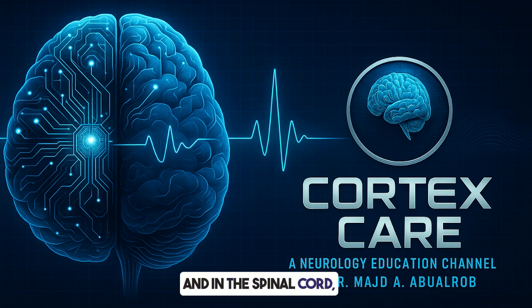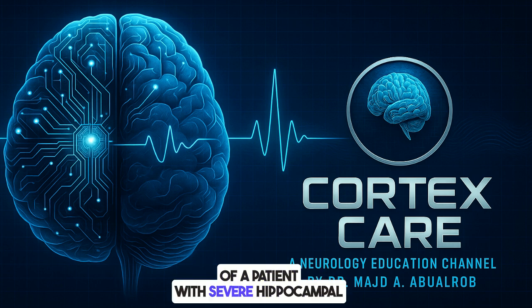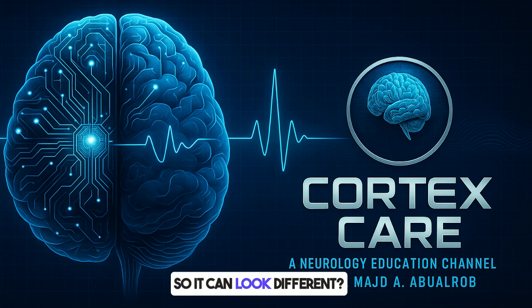And in the spinal cord, about half the patients have LETM, that longitudinally extensive transverse myelitis, usually in the thoracic spine. Is this pattern always seen, or is there variability? There can be variability. The paper mentions a recent report of a patient with severe hippocampal and degenerative brain atrophy, plus LETM, but without those typical hazy cerebral T2 lesions. So it can look different sometimes.